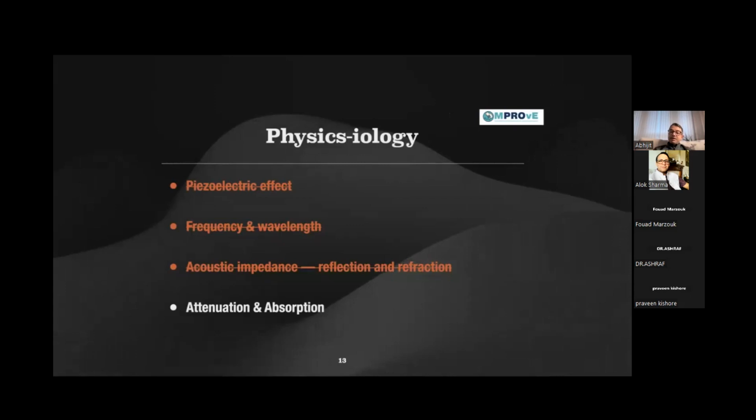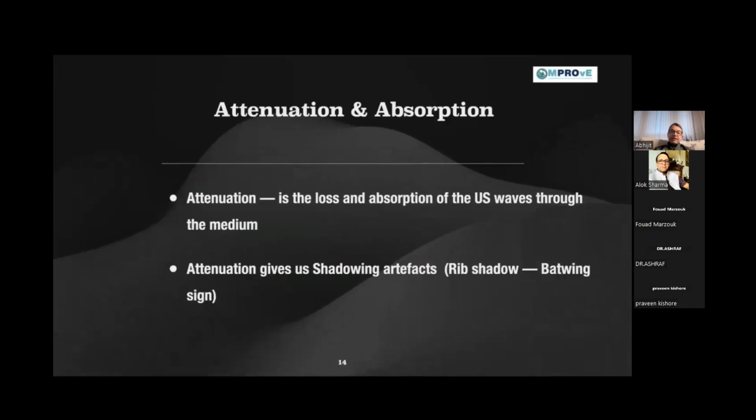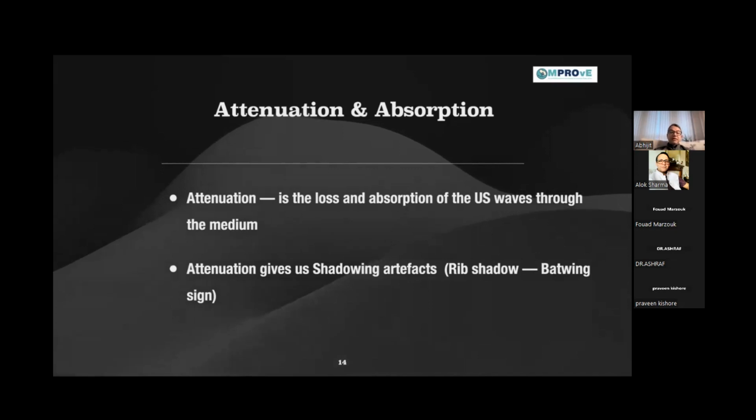What is attenuation and absorption? Again, when the ultrasound waves are passing through a medium, there will be a loss of energy. It's like trying to walk in a swimming pool: you need more energy to walk through the water, be it a swimming pool or by the beach side.